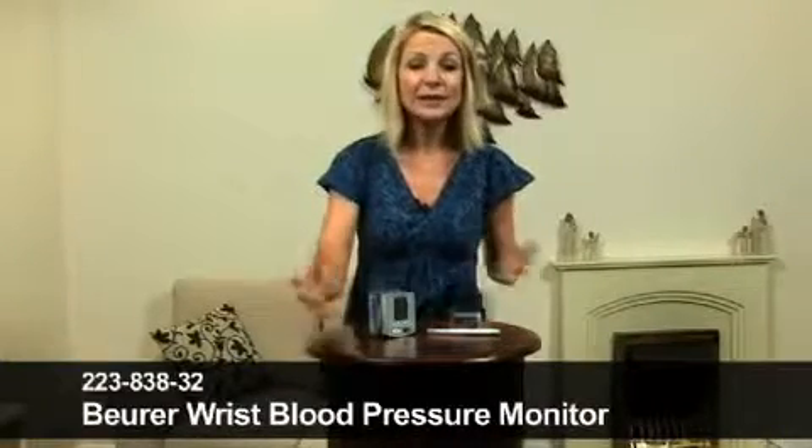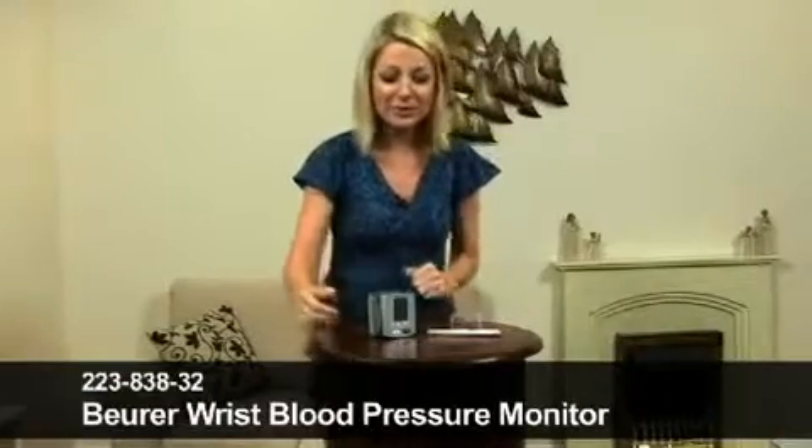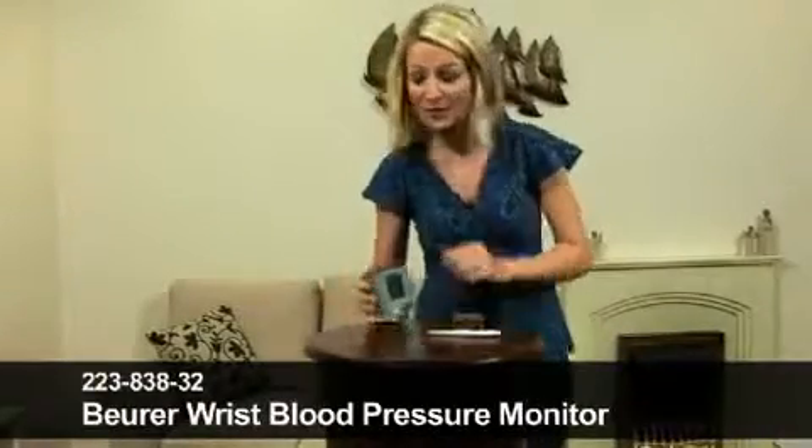It's the Beurer Wrist Blood Pressure Monitor. I'm going to demonstrate it for you. We'll take a look at my blood pressure and my pulse and see how much it's racing or not at the moment.